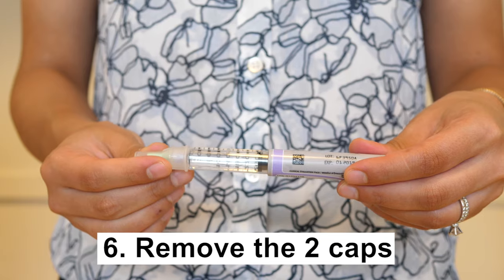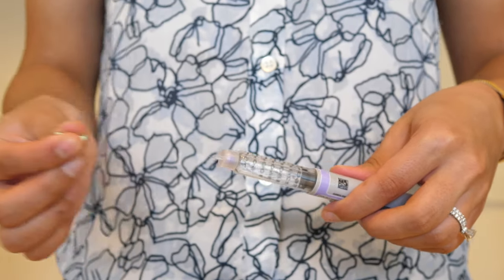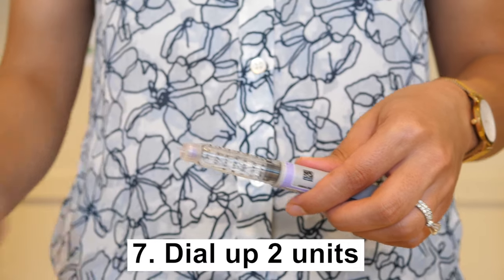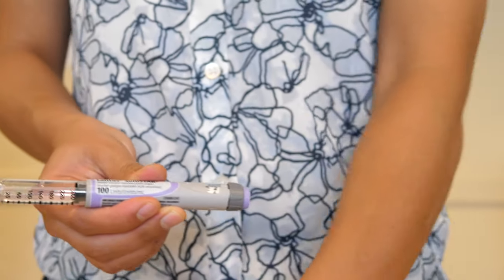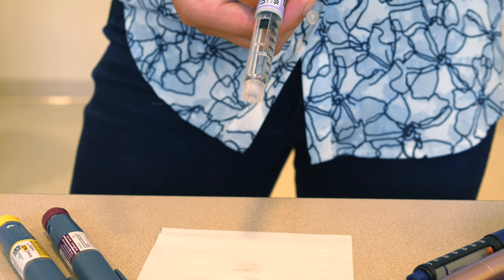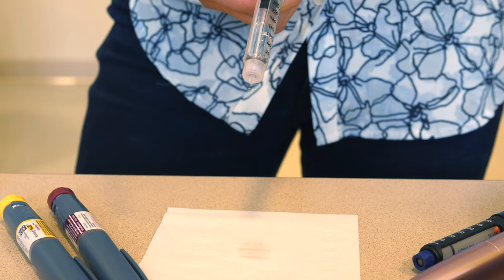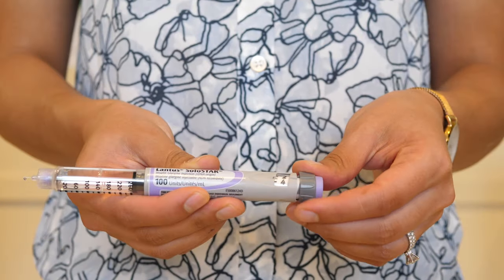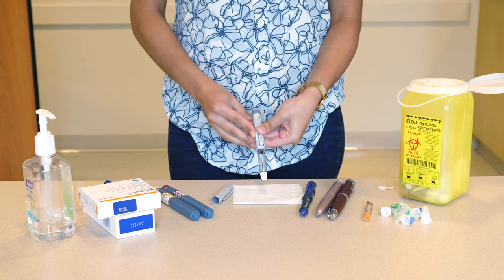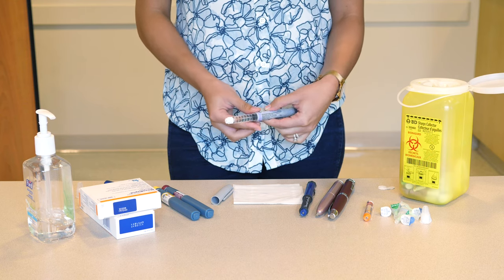Remove the two caps from the needle. Dial up two units. Push the bottom of the pen to release the air from the needle. Look for a drop of insulin on the end of the needle. If there is no insulin, dial up another two units and push the bottom again. Repeat these steps until you see insulin at the end of the needle.